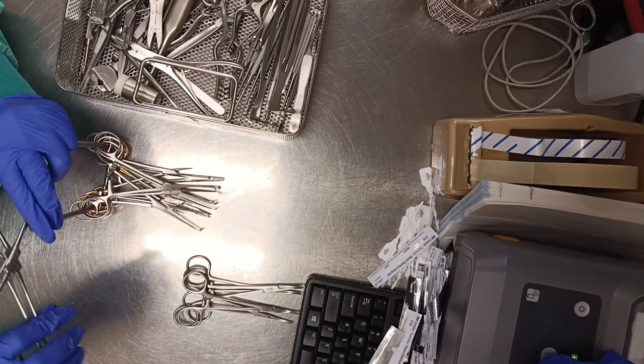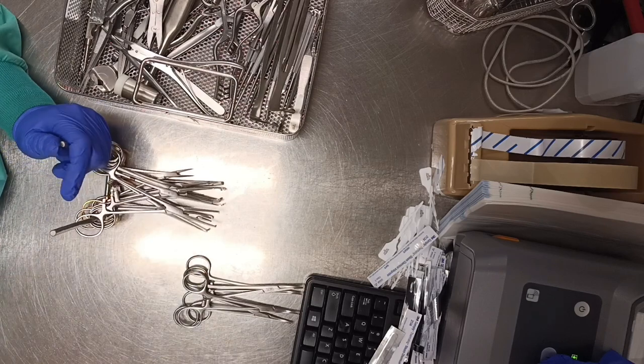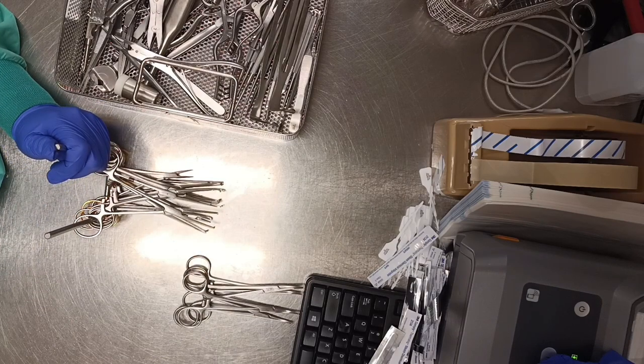So this is the next instrument. This is a Kocher. I'm not really sure how many inches that is, but that instrument is a Kocher.